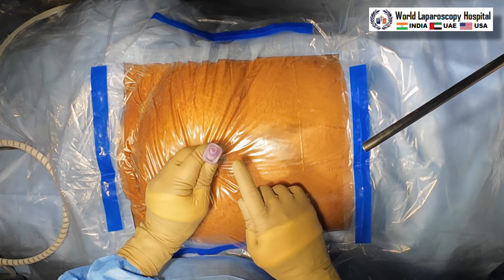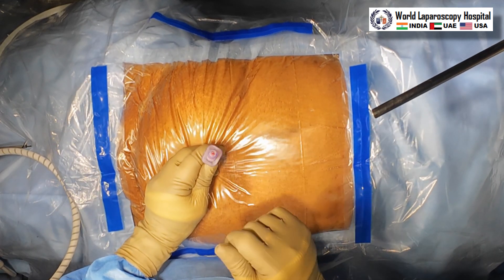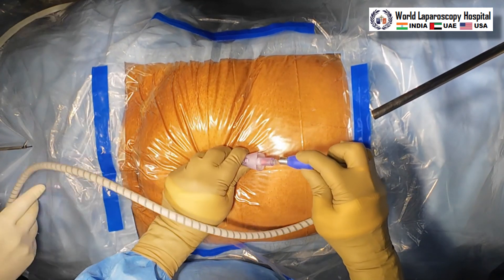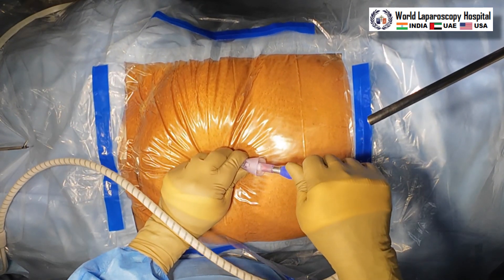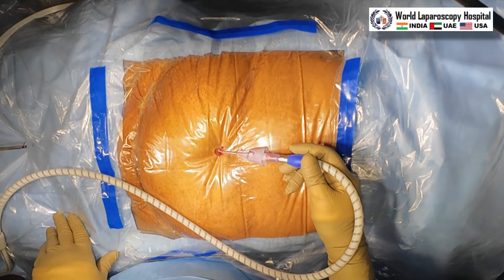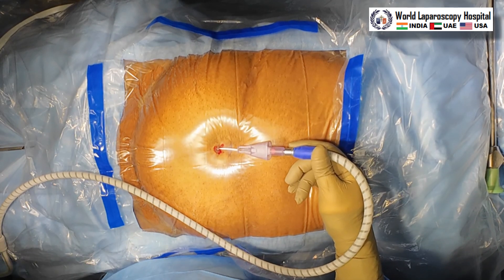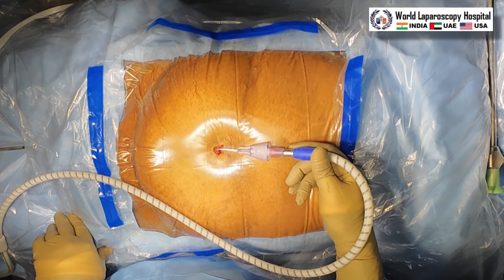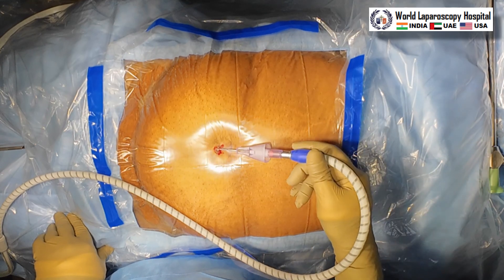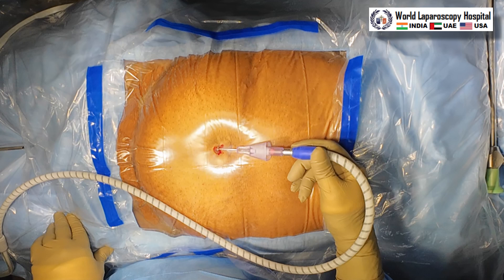After that we are attaching the tubing of the insufflator, and this ball is also sinking. Now the flow rate is as usual one liter per minute. Initially within a few seconds your actual pressure will be single digit, and we can see slowly the pneumoperitoneum is starting.